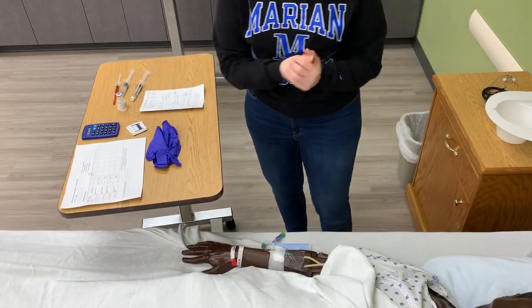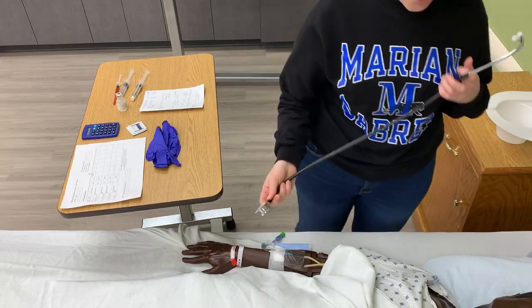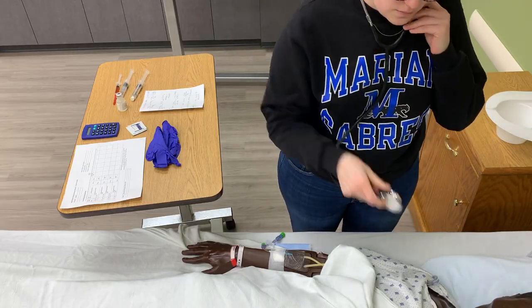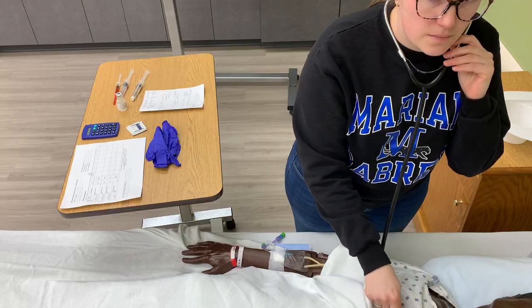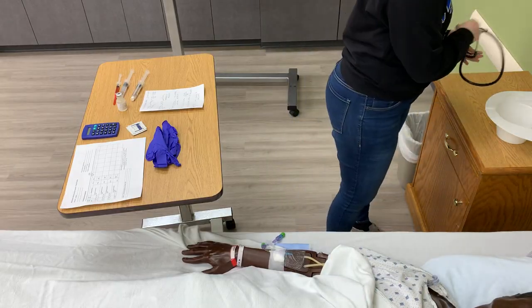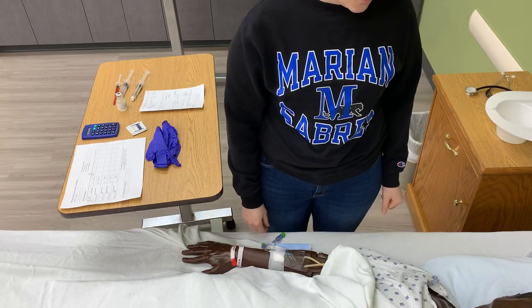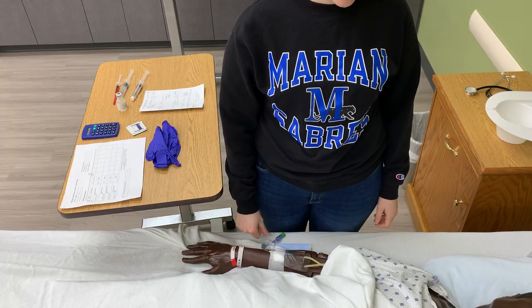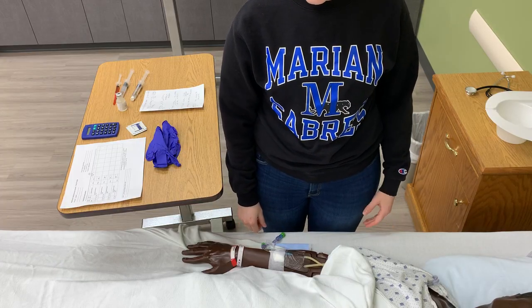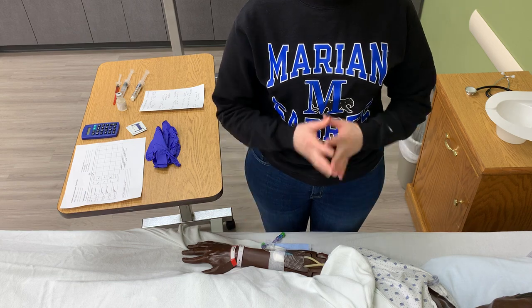So I'm gonna do hand hygiene again. And Casey, I'm just gonna take a listen to your lung sounds before we get started. So listening to lung sounds here, okay. And I did assess your output. You have not gone to the bathroom in the last 10 hours. So you're likely retaining all that fluid, which makes sense with your heart failure. So we're gonna keep a close eye on that after we give this medication.